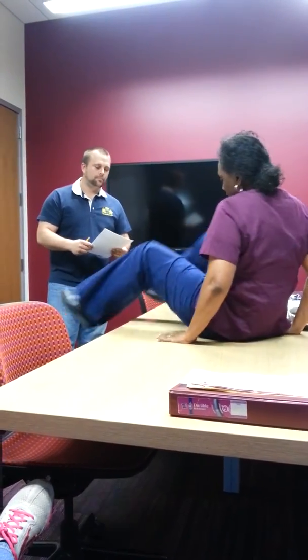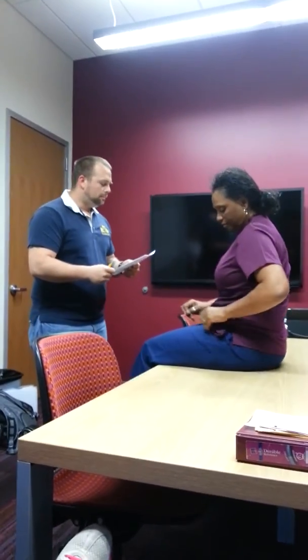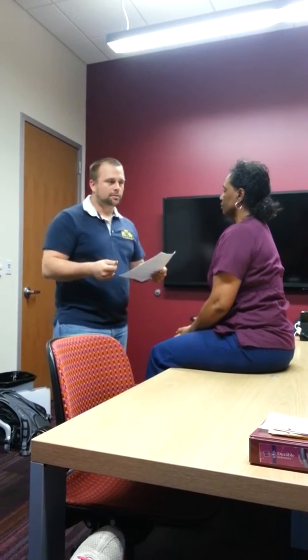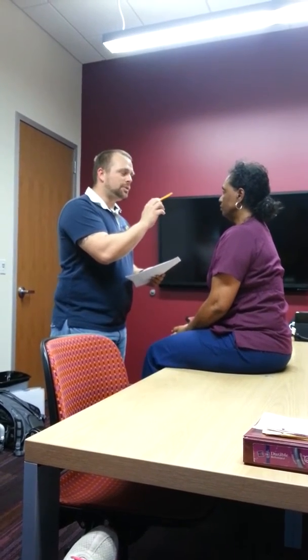Sure. Okay. At this time, I've already assessed her Glasgow Coma Scale, her level of consciousness, and now I'm going to go ahead and check cranial nerves, PERRLA, and everything that has to do with the head. Alright, so I got my pen light here. Now what I want you to do is look at the end of the pen and follow it with just your eyes, not your head. Okay?